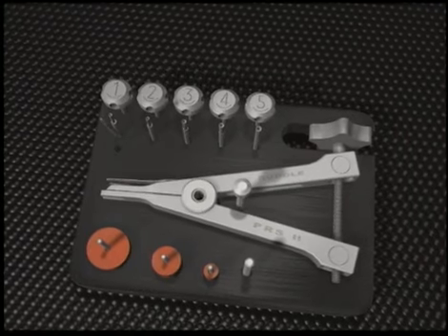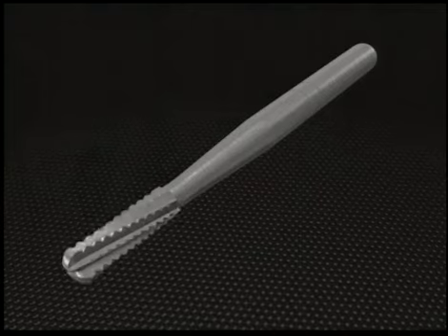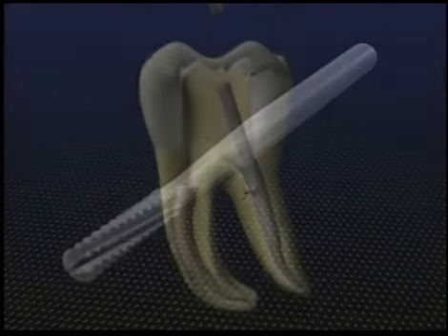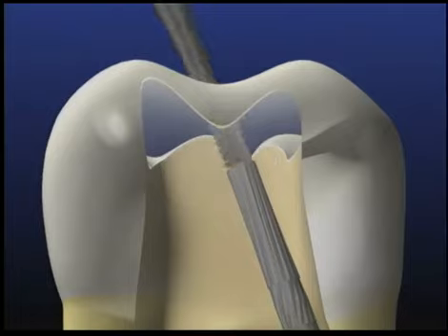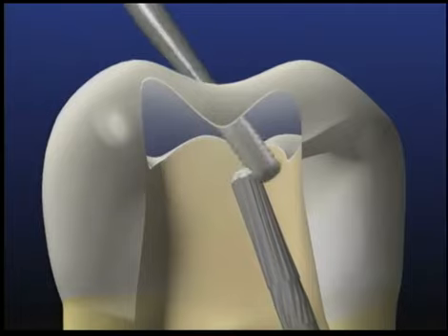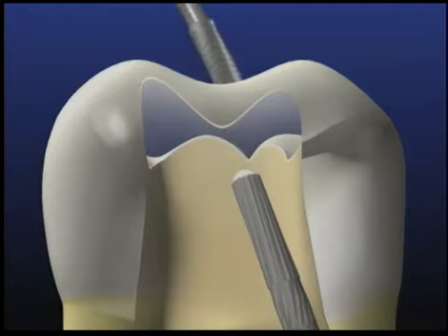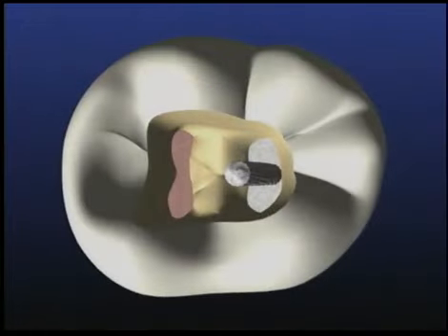When utilizing the PRS, the first step is to select a transmetal burr. This friction grip burr fits into a high-speed handpiece and its sawtooth blades efficiently machine metal. The transmetal burr chamfers and rounds off the coronalmost edges of the post. This activity is accomplished by moving the head of the handpiece in an orbital pattern above the post drill pivot point. The head of the post is now domed and will create a guide path for subsequent instruments.